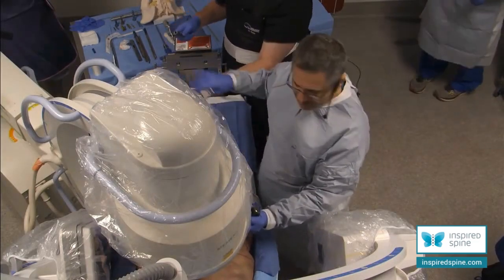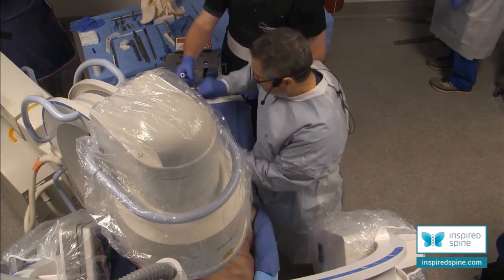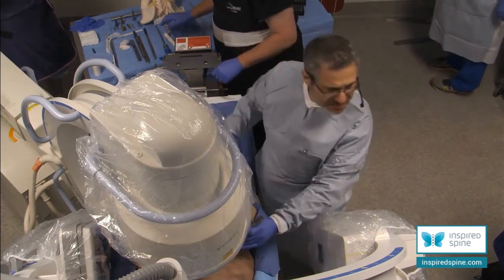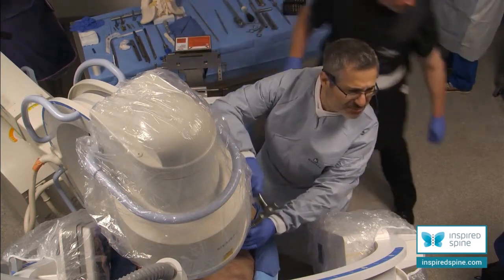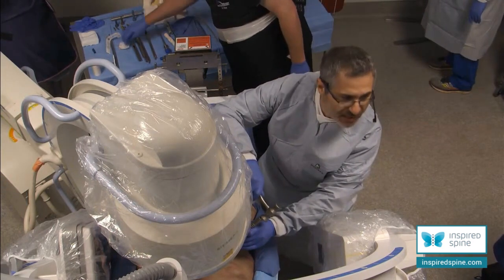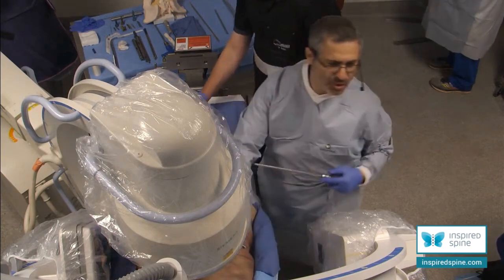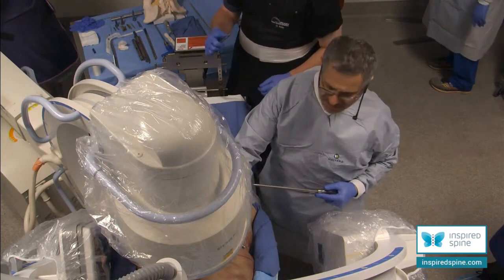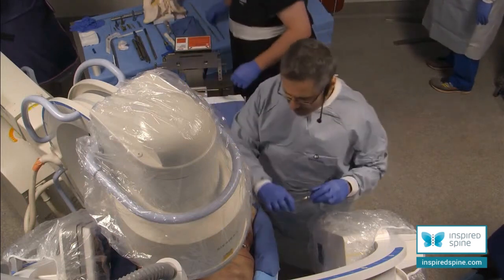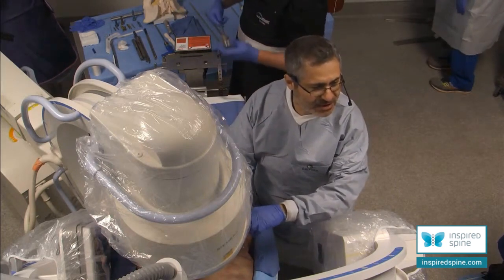Mallet back. X-ray. Both, both X-rays please. All the way to the other side. Tube and the barrel. X-ray. Mallet. Both X-rays. X-ray. Lateral as well — both X-rays please. This one is just on top. Tube. X-ray. I don't think the second one can. Drill. Yeah, we have the ability to do that. X-ray. So it's going to be a 3314. 3314.